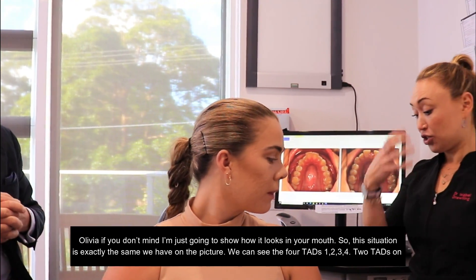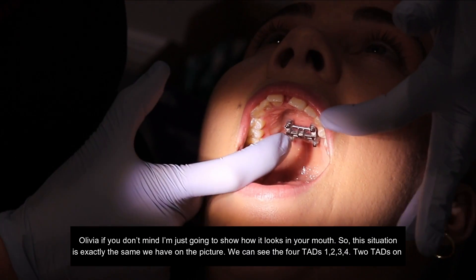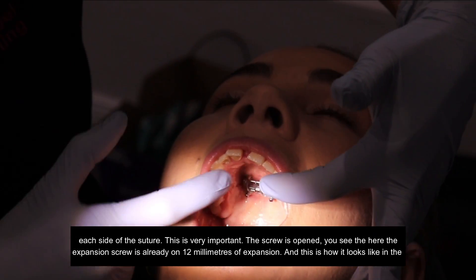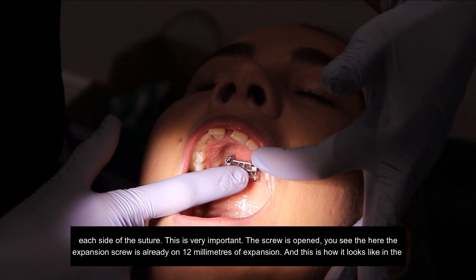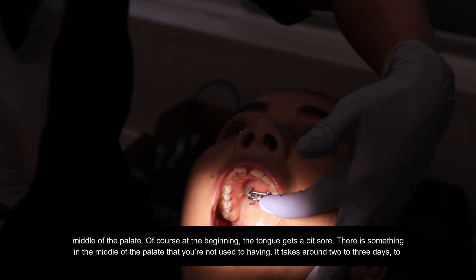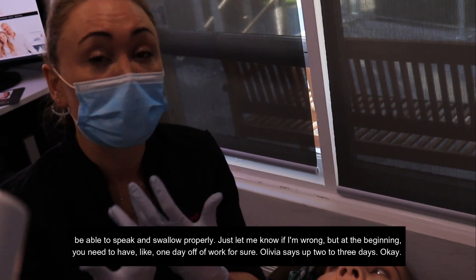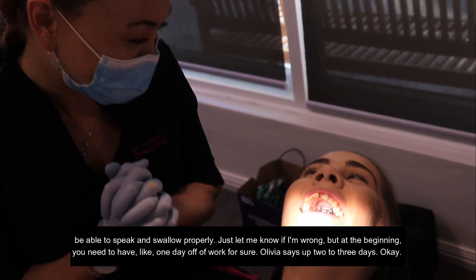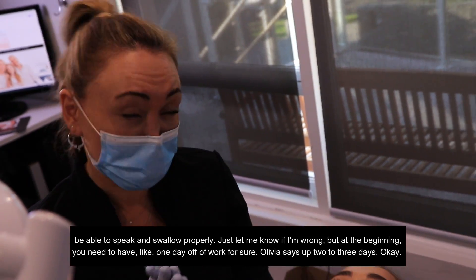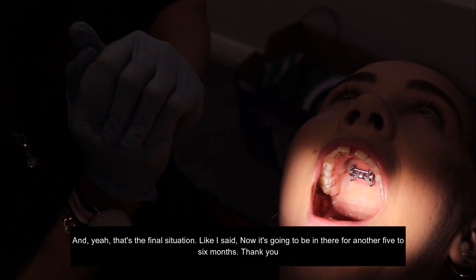Olivia, I'm just going to show how it looks like in the mouth. So this situation is exactly the same as we have in the picture. We can see the four TADs: one, two, three, four — two TADs on each side of the suture. This is very important. And the screw is opened — you can see the expansion screw is already at 12 millimeters of expansion. This is how it looks in the middle of the palate. At the beginning, the tongue gets a bit sore because there's something in the middle of the palate that you're not used to, so it takes around two to three days to be able to speak and swallow properly. You need at least one day off work — Olivia says up to two or three days. And now it's going to be in there for another five to six months. Thank you.